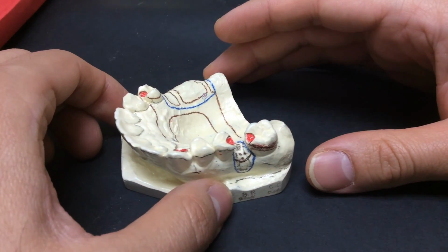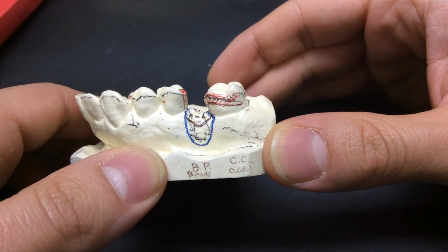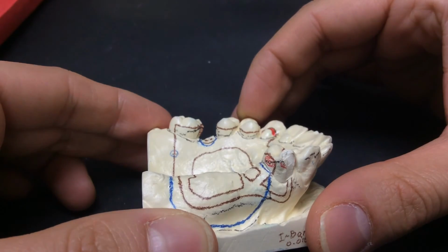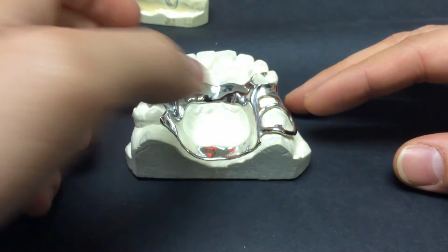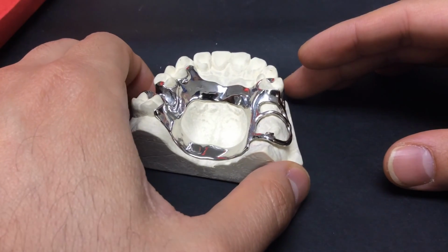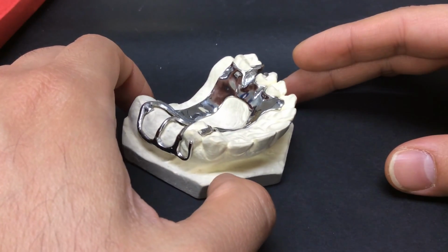If you look in the schedule, it tells you which cast you're doing, and if you look at the cast page, the image page, it will show you the cast. So you certainly can think about it ahead of time, which isn't cheating because we put it in the manual, and we're allowed to help you. It would be worthwhile to look at it ahead of time and make sure you know the variations between today's design and that design, which should be fairly close. All right?